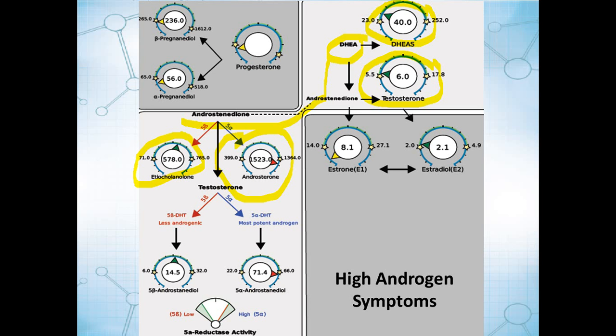And then over here, again, you've got elevations. You not only have an elevation, but what else you'll notice is you've got a preference for these alpha metabolites. So what does that mean? That means this woman's got a decent level of androgens, but because of the way her particular metabolism is running, you could really miss this because she's making a lot of DHT at the tissue level, but then she's also got a fair amount of hormone to start with.